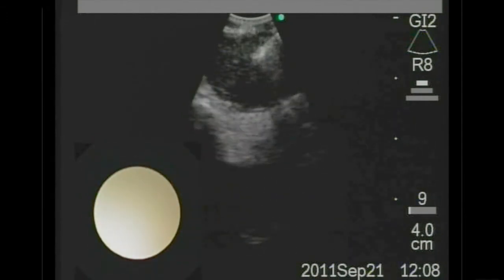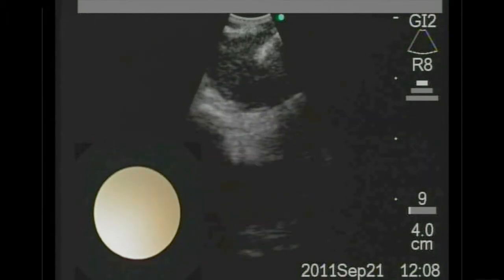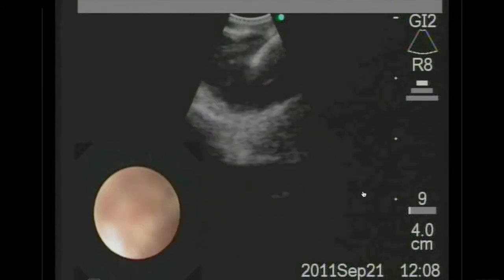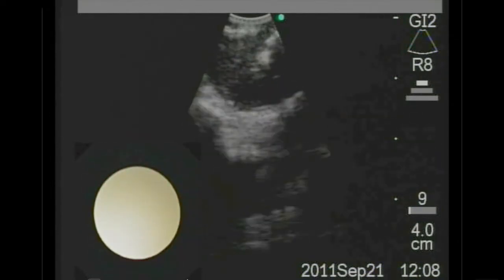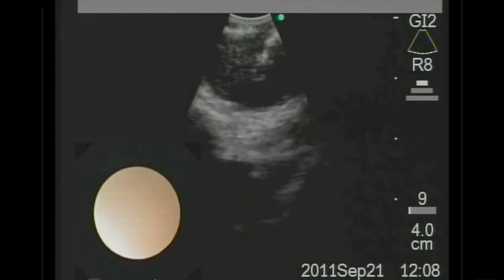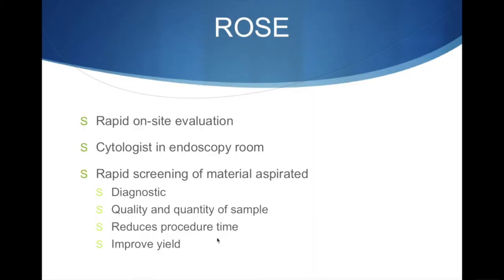Once the needle is into the lymph node we can needle it a few times to aspirate cells out of that lymph node. ROSE stands for Rapid On-Site Evaluation — this is where we have a cytologist in the endoscopy room to rapidly screen aspirated material to ensure that we have a diagnostic sample and enough sample for all the additional testing that will be required on those malignant cells.